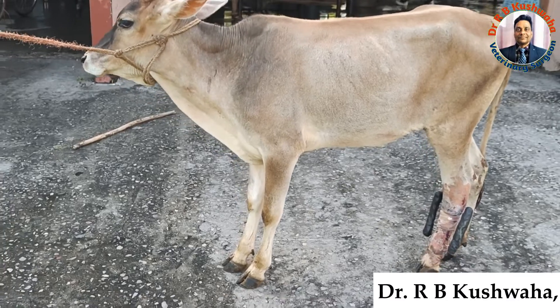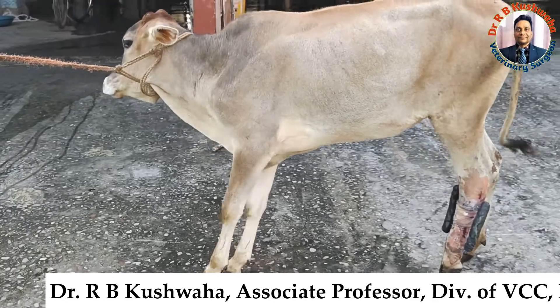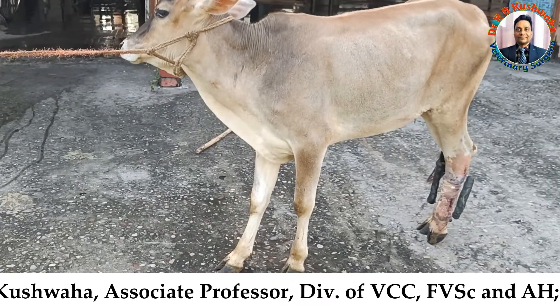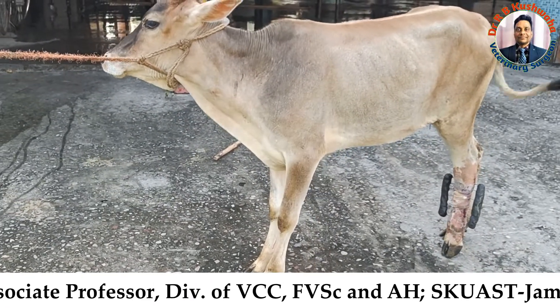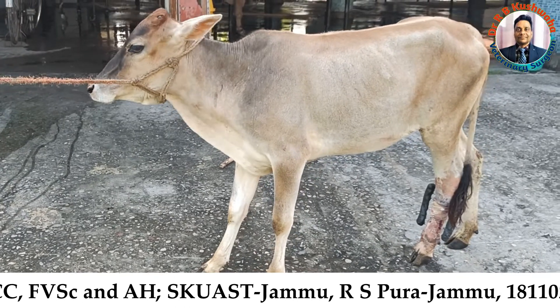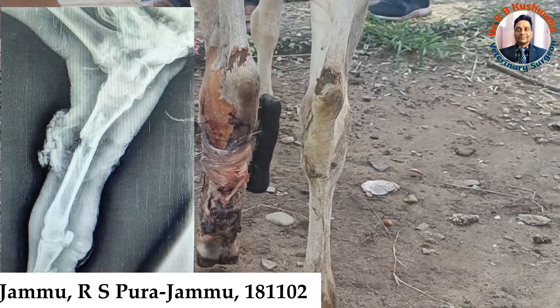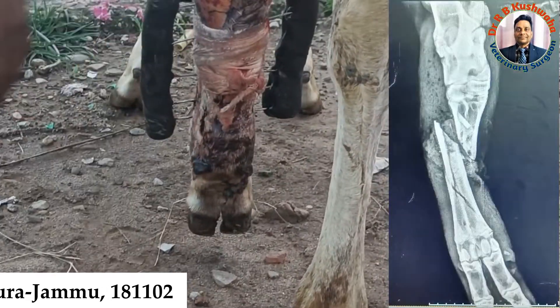this heifer is 11 months old and had a history of unknown trauma at the left metatarsal site. It has a severe compound fracture with maggot infestation — basically a compound fracture at the medial aspect.